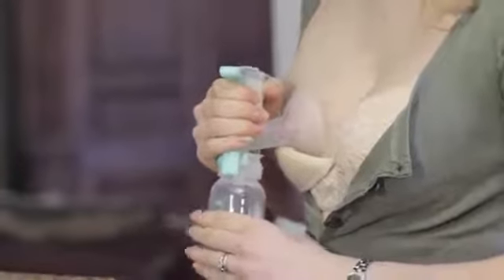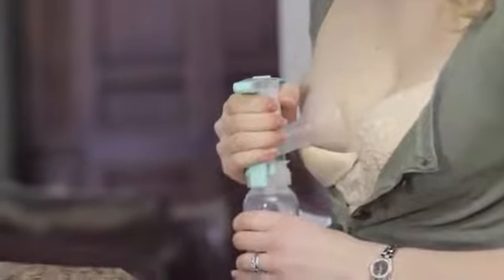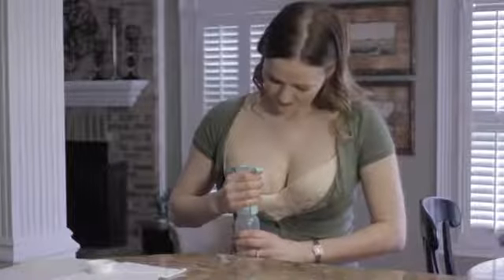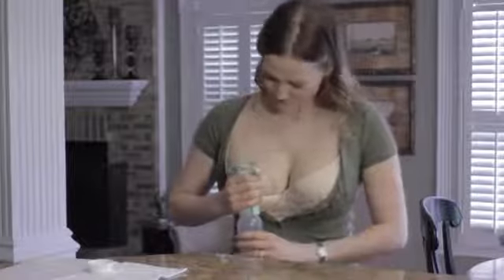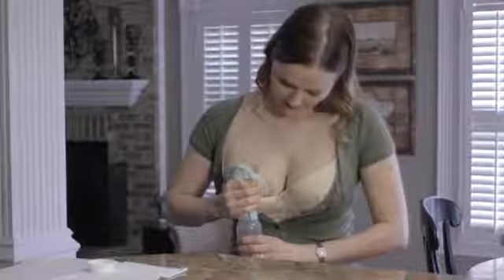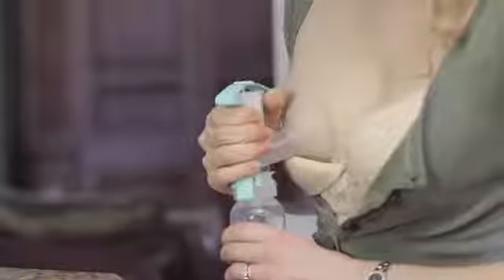Center your nipple in the breast flange and hold the flange to your breast to make an air seal. Tilt the flange slightly downward so milk flows into the bottle. With the one-hand breast pump, you can control pump suction and pump speed just by squeezing the handle. The harder you squeeze, the stronger its suction. The faster you squeeze, the greater its speed.